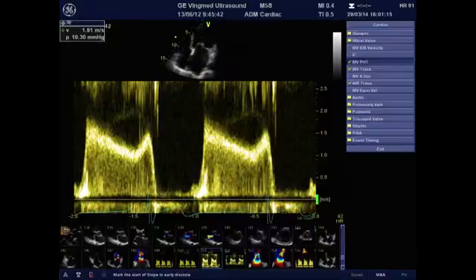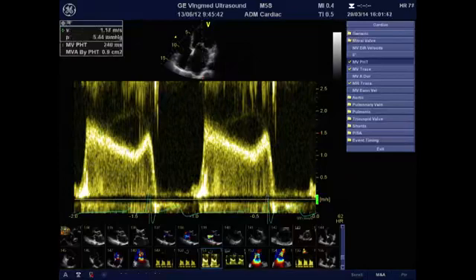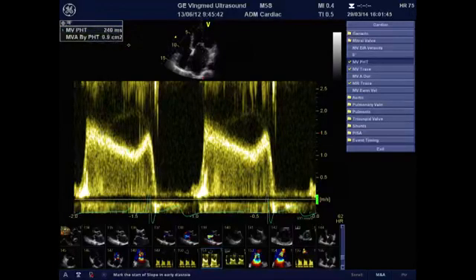So the pressure half-time has to be measured on the first slope of the diastolic tracing, which corresponds to the E wave. And actually, if you have a patient who has two slopes, the slowest one has to be taken into consideration. I will just do the measurement here. I will try to stay parallel with the slope. I will choose the slowest slope, and you see here that by pressure half-time method, I have a mitral valve area of 0.9 centimeters square.